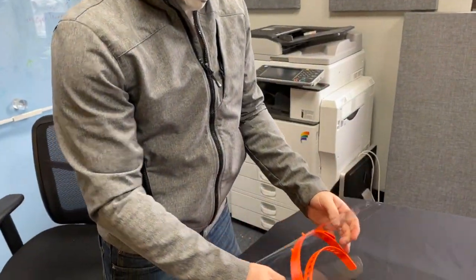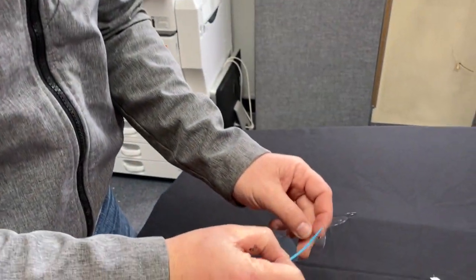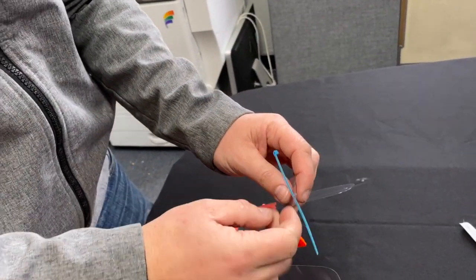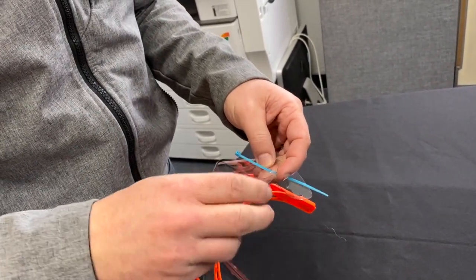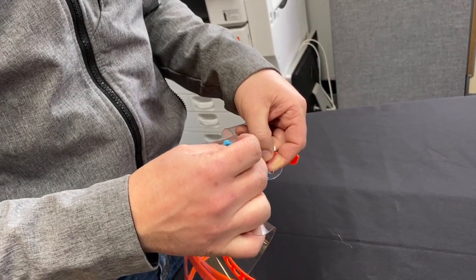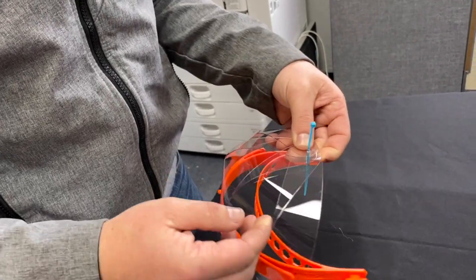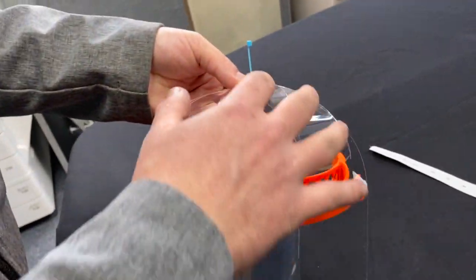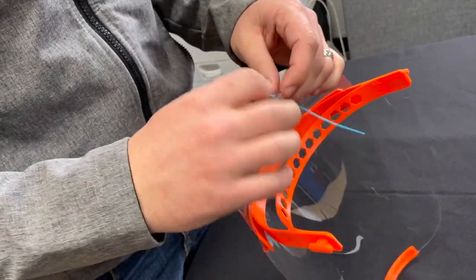To close the top you take a standard zip tie or anything else that you have available. Insert it through the middle one first and then bring the left one behind it, the right one behind it, the next left one behind it, and the next right one behind it. You do it in that order to make sure that it's going to prevent any droplets from catching in as these are layered together.